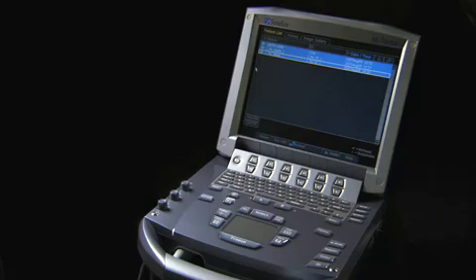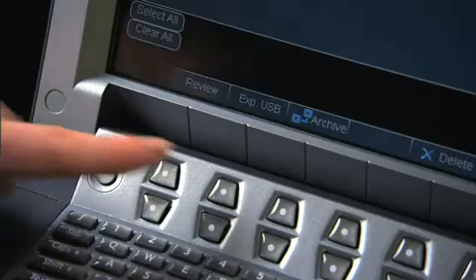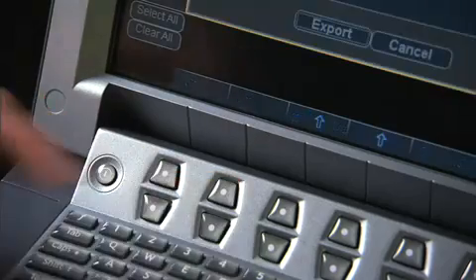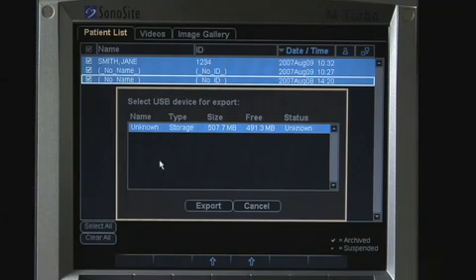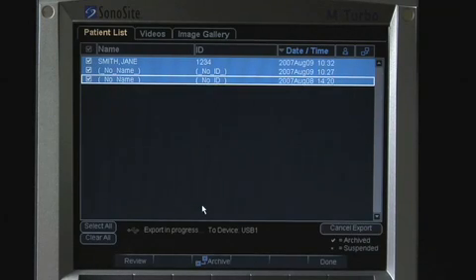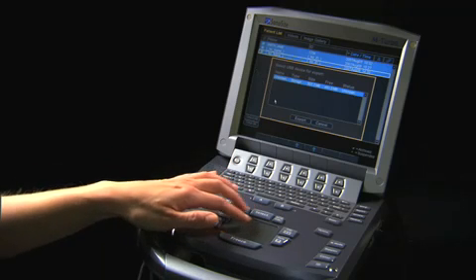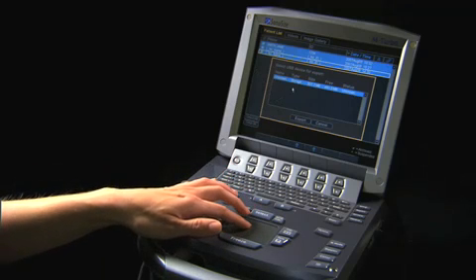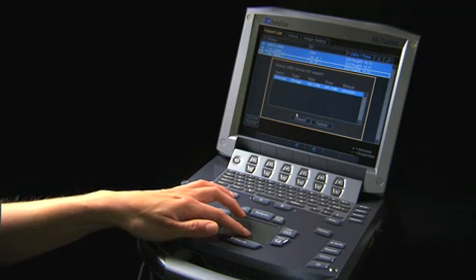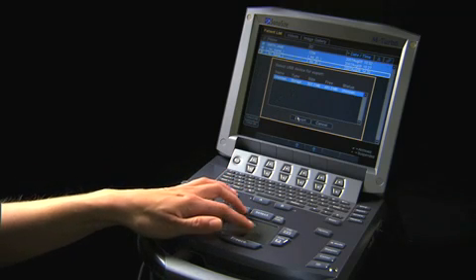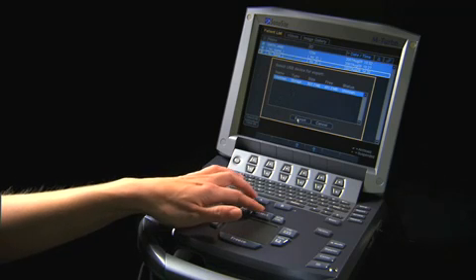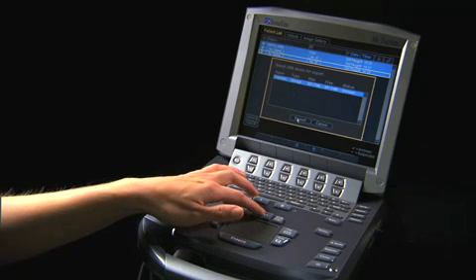Once you have completed the selection, select Export to send all images to the USB device or archival device. Up to three USB devices may be connected to the system at one time. Select the USB device prior to exporting images.